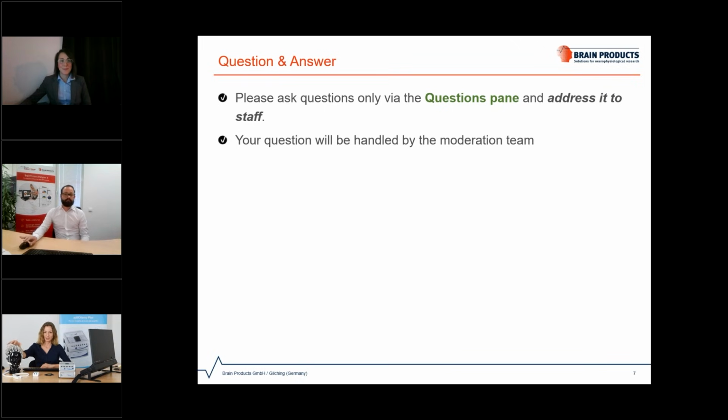I think I briefly mentioned it in the presentation, so you can record with it for an hour for sure, maybe 1.5 hours. Depending on how warm it is, the sponges are gonna dry out slowly, so the signal quality, the contact between electrode and scalp, is gonna decrease. So if you're using the RNet, you're basically limited to say 1.5 hours before you would have to add more liquid, which you can do with a pipette if you want to.